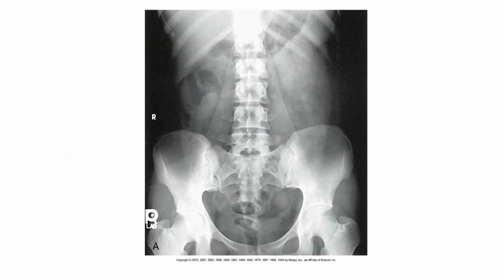All right, so this is the end result of the abdomen flat plate, the KUB, the abdomen supine. What I can see here, I'm going to start in the upper right-hand corner. There's ribs there, and those ribs are striped over a triangle-shaped object that is basically all one color gray.